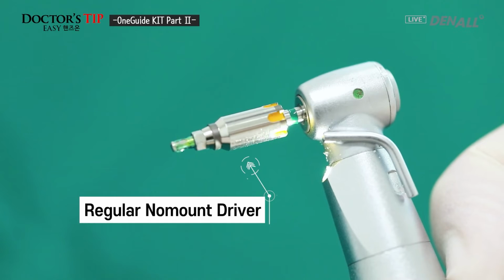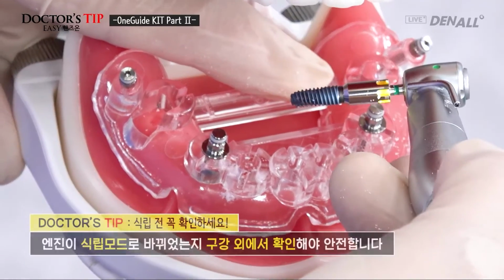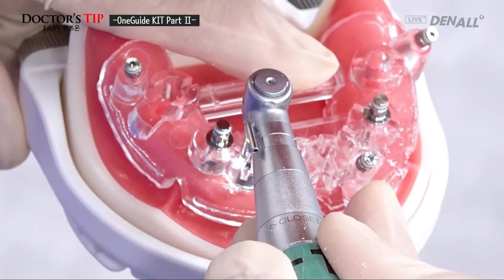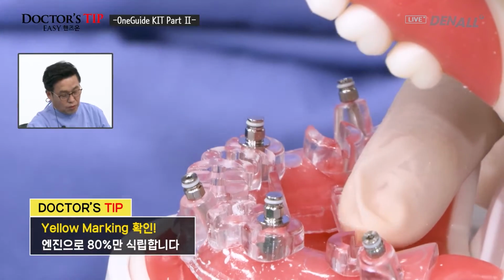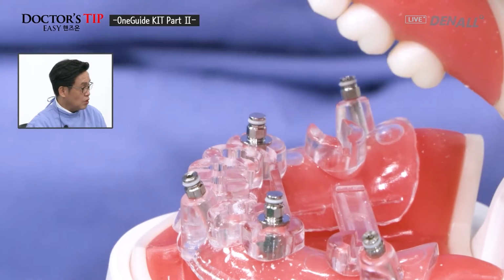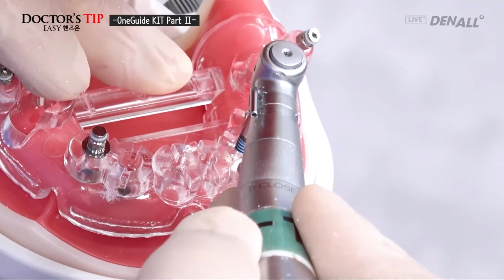Change the drill to placement mode. 4.0 by 10 millimeter fixture. Check whether it's on placement mode. You need to be careful. The fixture will be drilled in approximately 80%, and a 4.0 by 10 millimeter fixture will be placed. Check once again on number 33 fixture.